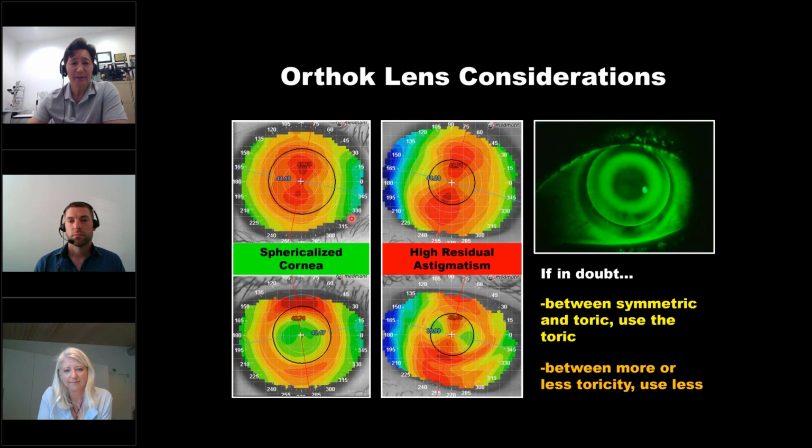Now you'll notice here in this Ortho-K on this apical astigmat, we did a really good job of sphericalizing the cornea, of pushing the astigmatism out of the way. But in this limbus to limbus case, we've basically left all of the patient's cylinder there. So there are times, as Mette described, that we're going to be able to move it out, and there are going to be times when we may not do much to alter that astigmatism. And clearly, the landing has to be altered for each eye to ensure that we have that 360 degrees of alignment.